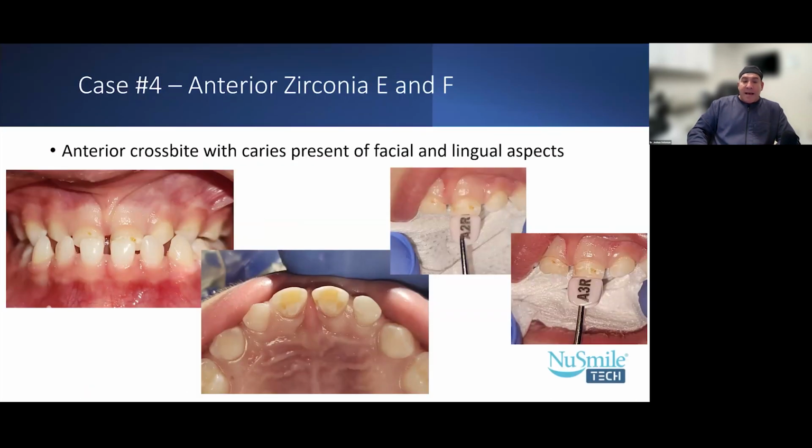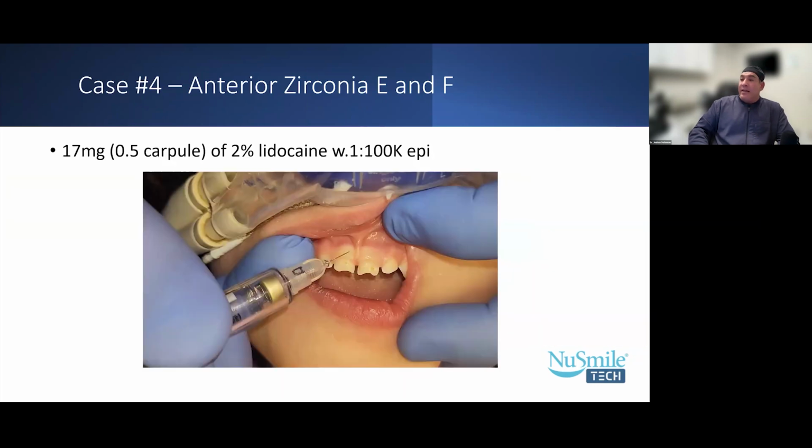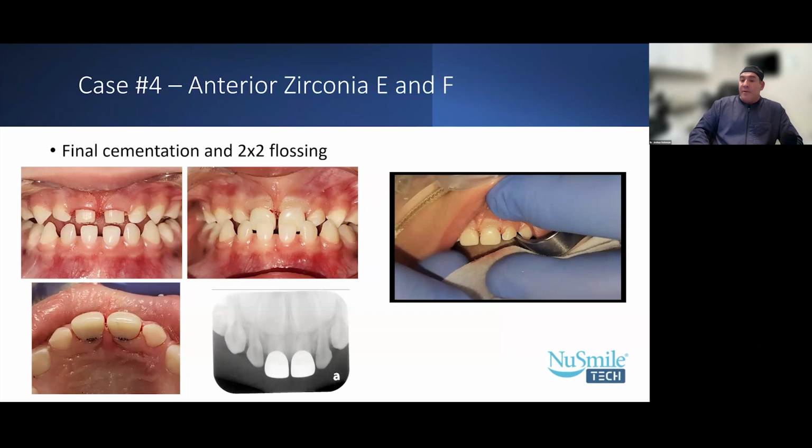When you're giving in the max anterior, the one thing we need to be careful with is when you have a lot of soft tissue in the way. We see a lot of patients that have these thick frenums, so you may need to give slightly lateral to that, okay? Case in point here. The more soft tissue that you're injecting through, it is possible that soft tissue is going to plug up your needle. So I try to go slightly lateral to the frenum there. And from that single injection, I know from canine to canine that patient's going to be profoundly numb.